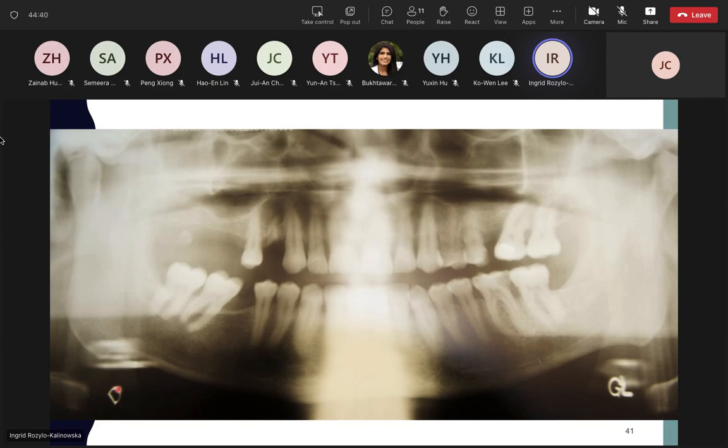So this marker, which is like D, if you know French, it's D for droite, so the right. It produced a ghost image on the other side of the radiograph, and this one, I think it must have been gauche, like left in French, and then someone added L like left in English and lewy in Polish.